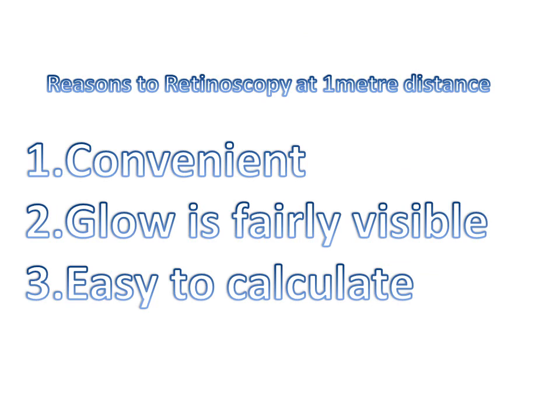Many a times you will be asked in the Viva as to what are the reasons to do retinoscopy at 1 meter distance. So the distance is convenient, glow is fairly visible, and calculation of the power is much easier when you sit at a distance of 1 meter. These are the reasons as to why you do retinoscopy at a distance of 1 meter.